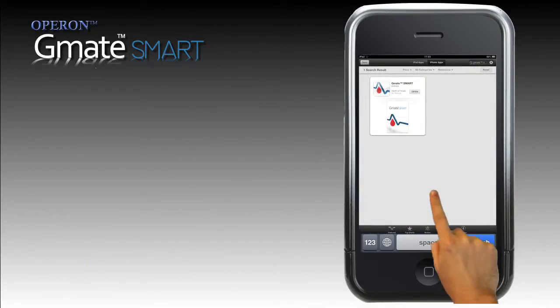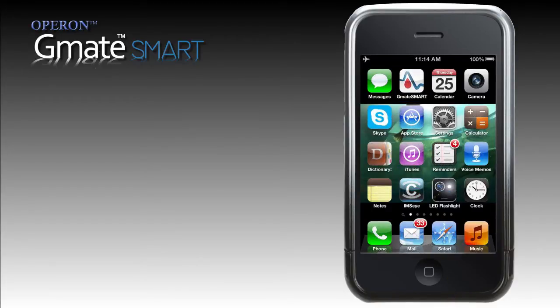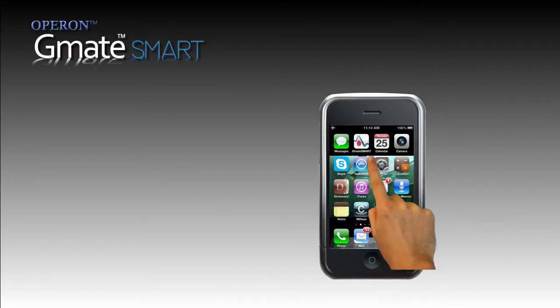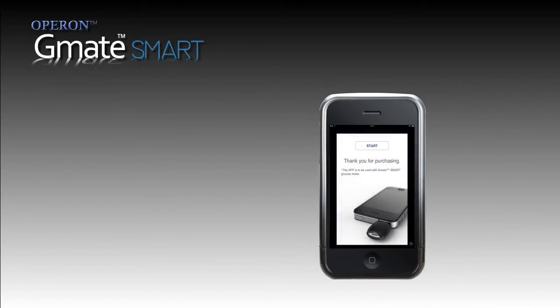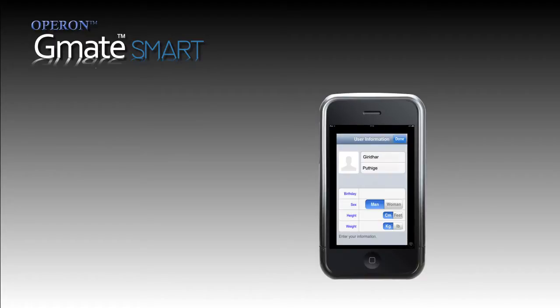Select GMATSmart from the list and install. Once you download the GMATSmart app on your smartphone, click on the GMATSmart icon. The application opens up. Complete the next steps as guided and fill your details in the user information sheet.